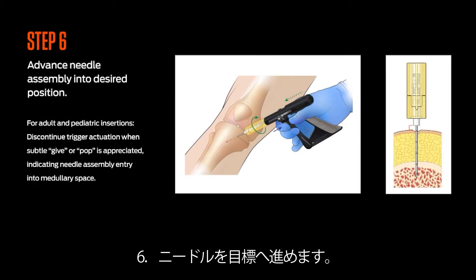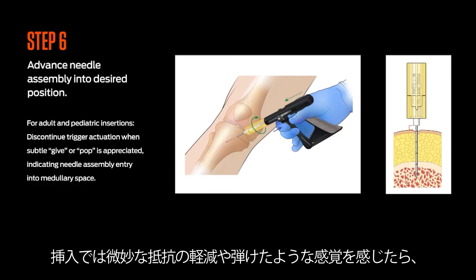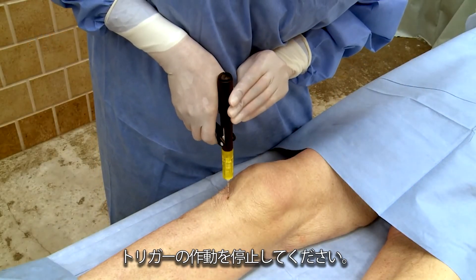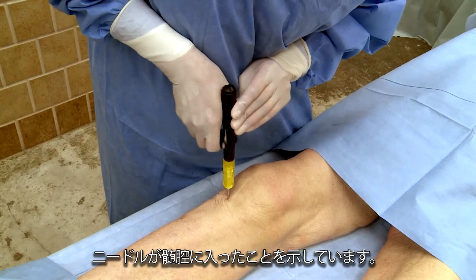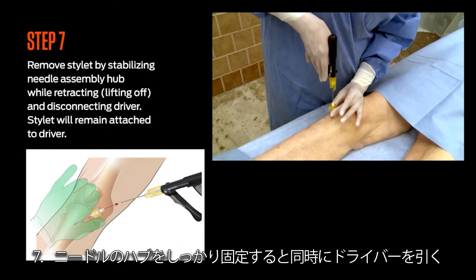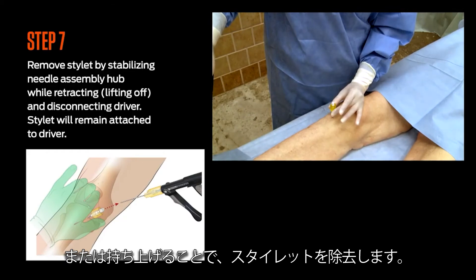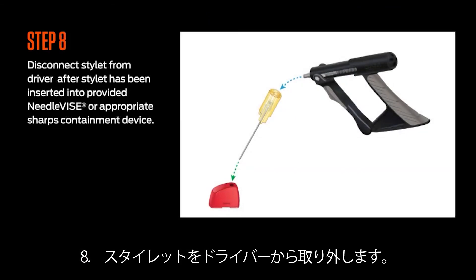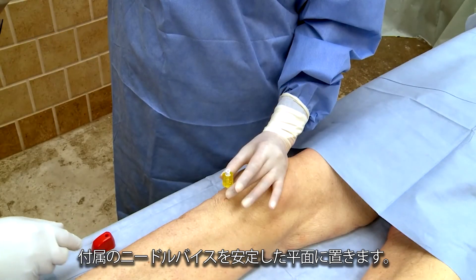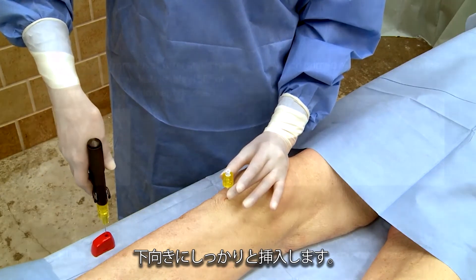Step 6: Advance the needle assembly into the desired position. For adult and pediatric insertions, discontinue trigger actuation when a subtle give or pop is appreciated, indicating needle assembly entry into the medullary space. Step 7: Remove the stylet by firmly stabilizing the needle assembly hub while simultaneously retracting, lifting off, and disconnecting the driver. Step 8: Disconnect the stylet from the driver. Place the provided needle vise on a flat, stable surface. Firmly insert the stylet directly down and into the open needle vise.